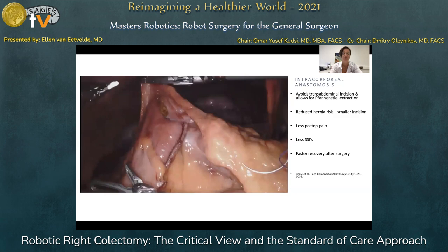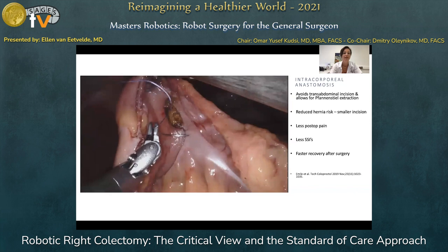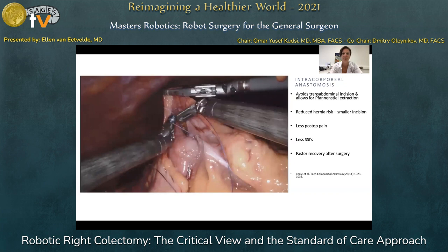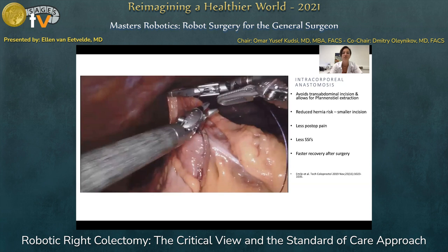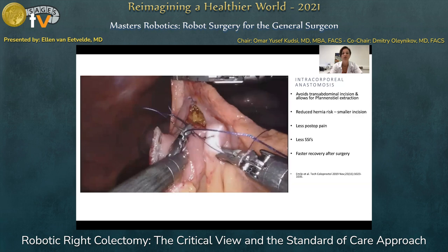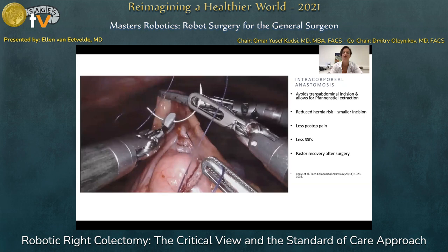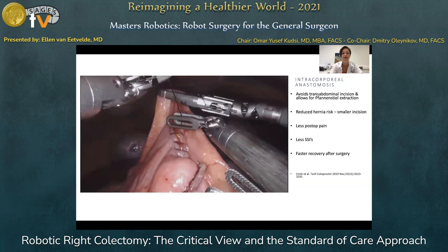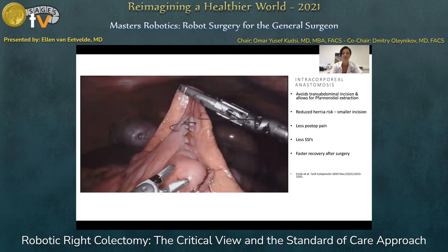We then lift up the remnant enterotomy for subsequent closure. We like to perform a suture from bottom to top because in our experience the bottom stitches are the most difficult to place when left for last. When using the robotic platform, suturing in this way does not pose any problems. We like to perform a running suture using Vicryl 3-0, but a barbed suture such as V-lock is also a very good alternative. We perform a single layer, but a double layer is fine as well.